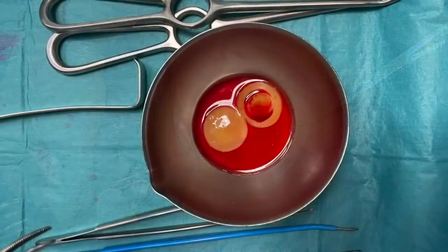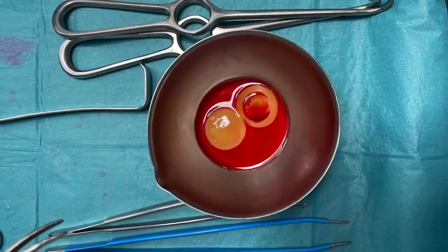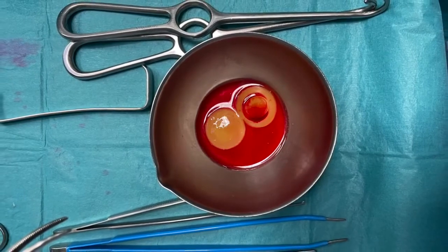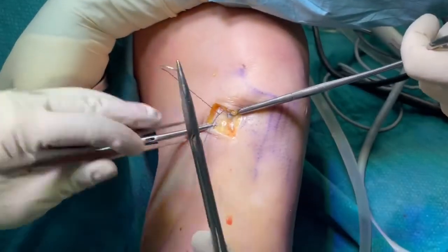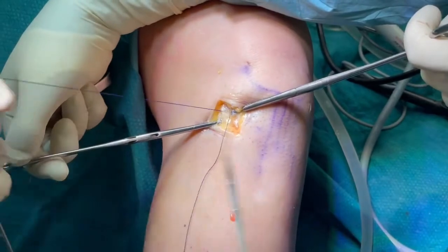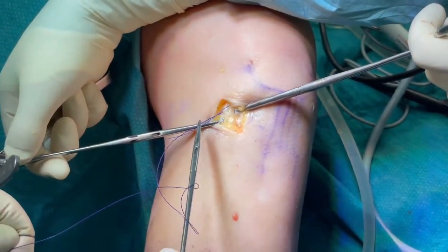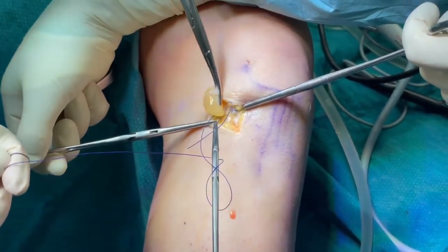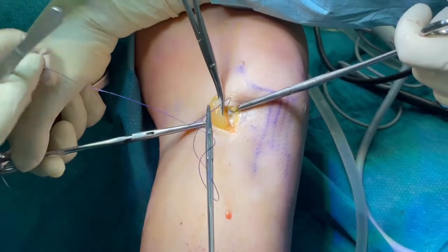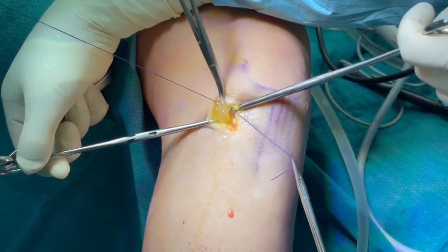The membrane is obtained by high-speed centrifugation of a small quantity of PRP. Finally, the autologous platelet-rich fibrin matrix is harvested by a side-to-side suture in the inner layer of the meniscocapsular junction.